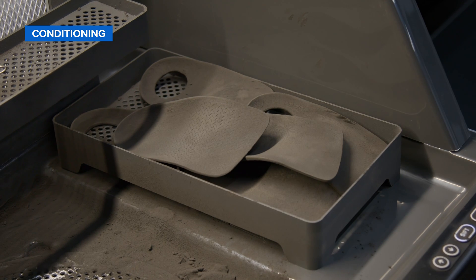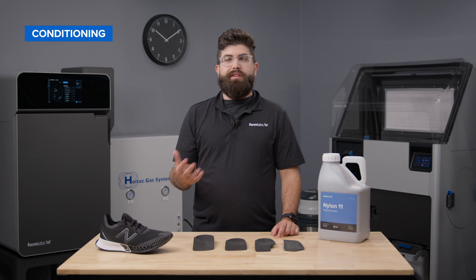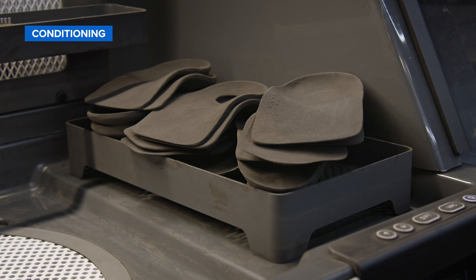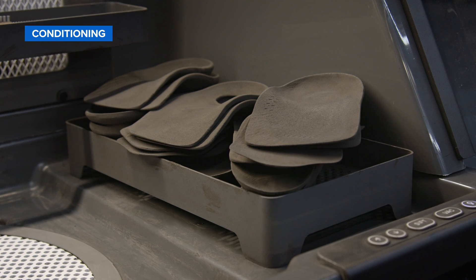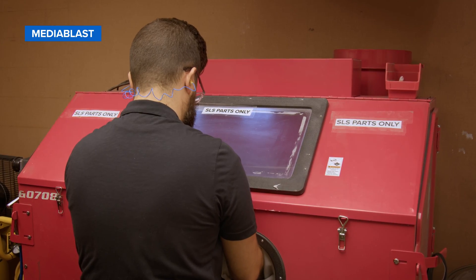After the printing and sifting process, the parts will be pretty dry with a very low moisture content. Ideally, allowing the prints to condition for at least a few hours at room temperature will allow them to absorb ambient moisture in the air and become more durable for additional post-processing steps, like media blasting and grinding.